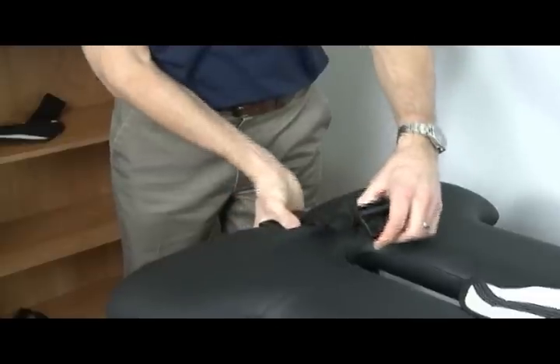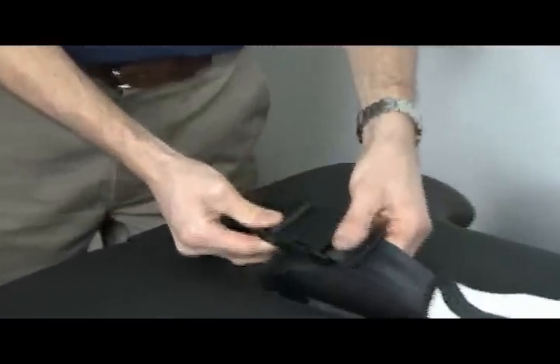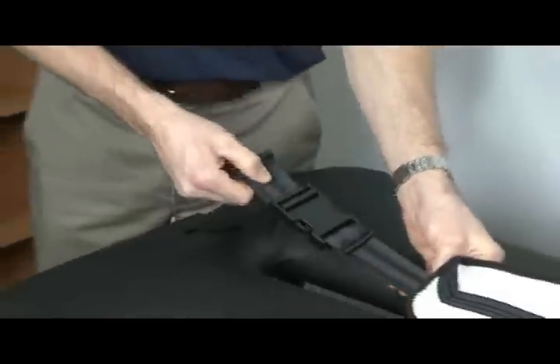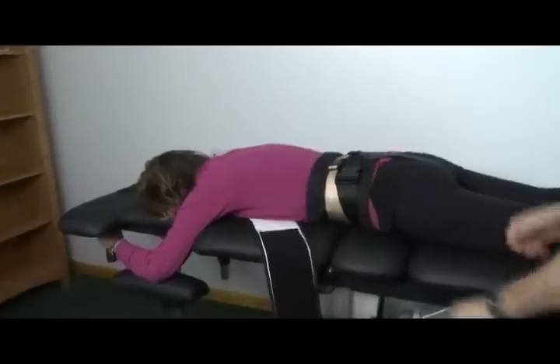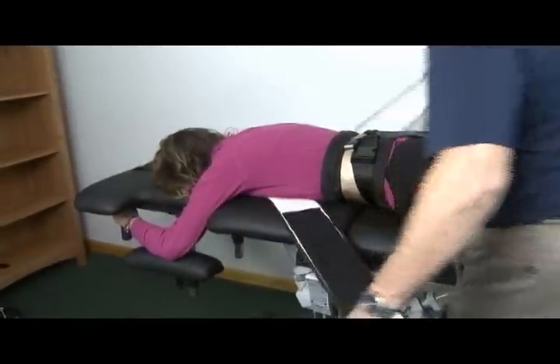If using a wing vest as a thoracic restraint, place the wing vest as shown. The wing vest is designed to engage the bottom of the patient's rib cage and be fastened snugly.